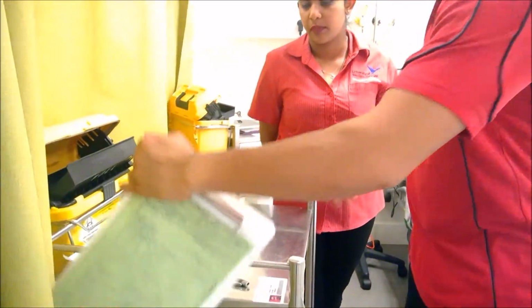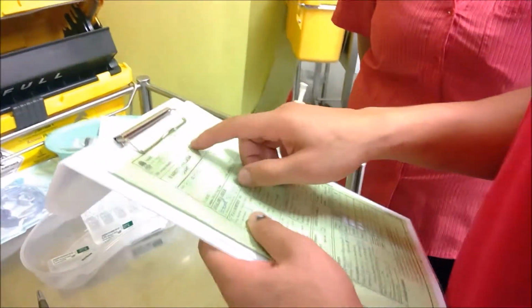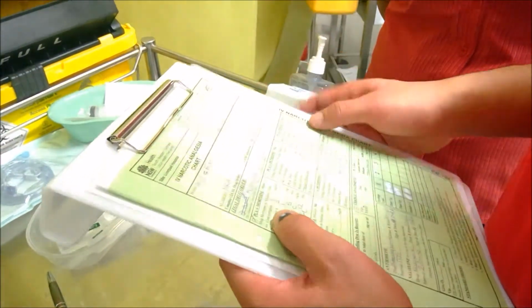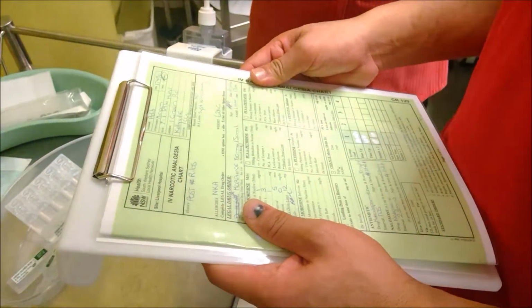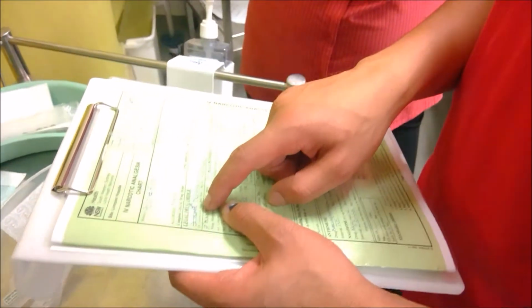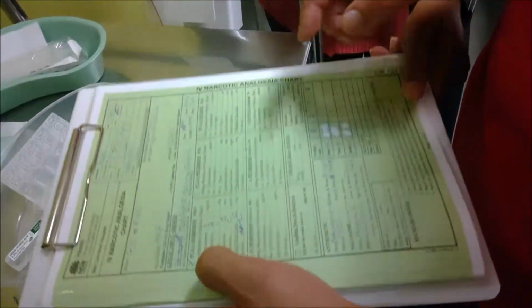Yep. Going to do our first drug check. Okay, so we have Mary Madib. Her date of birth is 7 of the 1st, 1969. MRN number is 174963. She has no known allergies. We've checked her ID and allergy status, and it all matches up. She's coming for post-fractured ribs. The doctor has signed for morphine 50 milligrams in 50 mils through a PCA order.